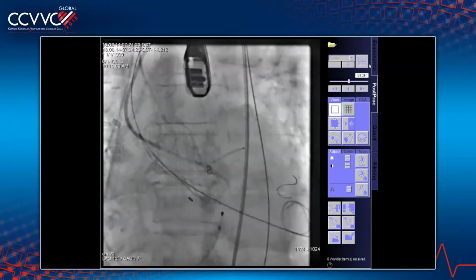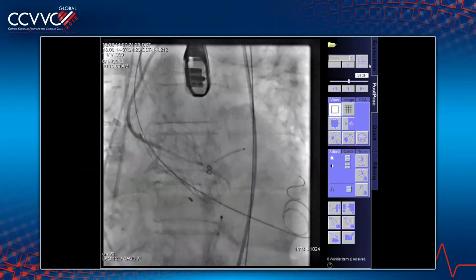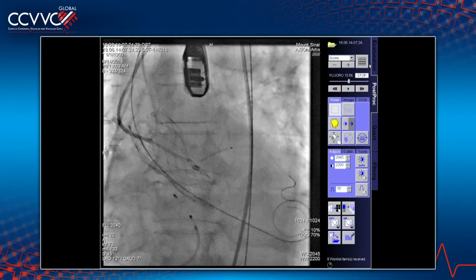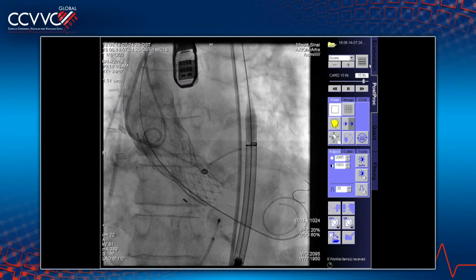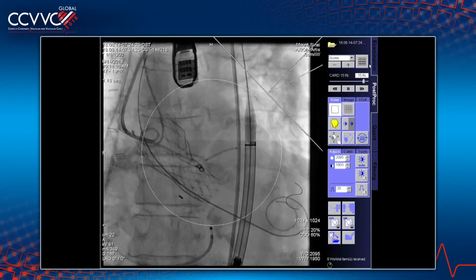Post-dilatation. No, I mean, you should measure the gradients first, and then decide. You need the gradient. Post dilation, please. No, first let's see the gradient. I don't think we still have to dilate again. You feel like you need to dilate? What's the reason for that? Why do you feel like you need to post-dilate without knowing what your gradient is up front?